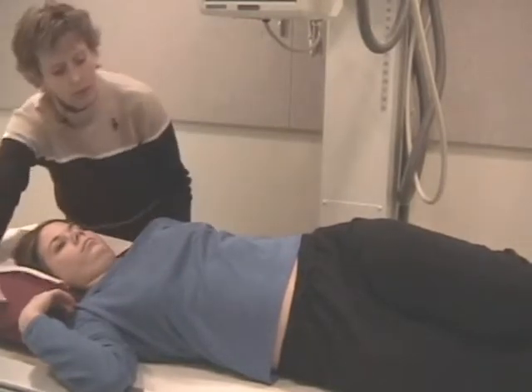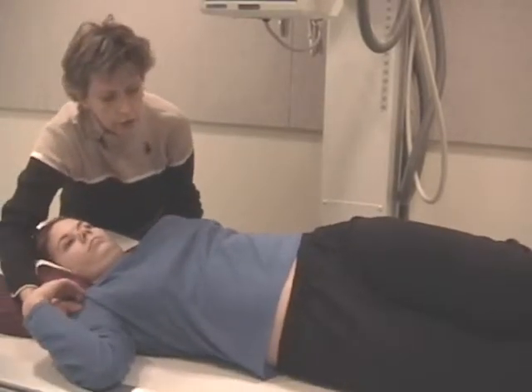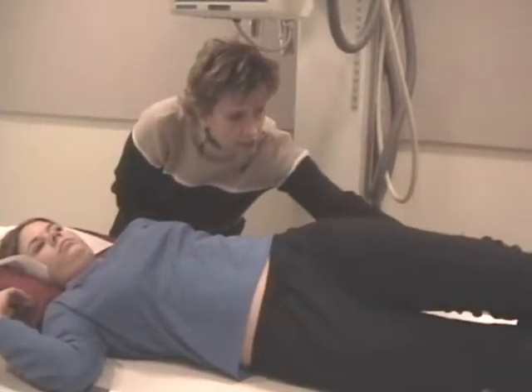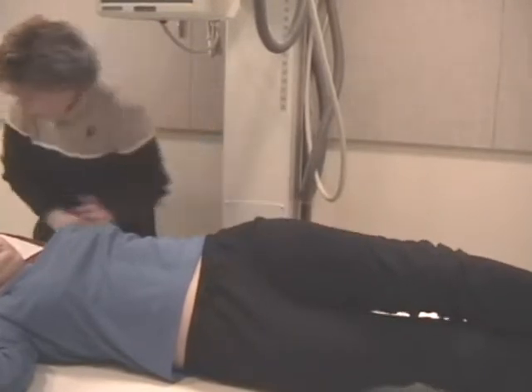Okay. Again, you want them straight on the table, so I'm going to adjust her just a little bit. There we go. Now you can extend that knee just a little bit. Is that more comfortable for you? Okay.